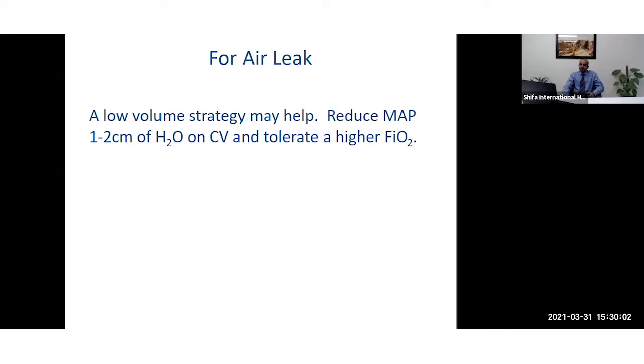For air leak syndrome, sometimes we might need to use a slightly low volume strategy by reducing the MAP and tolerating a higher FiO2 requirement until the air leak is settled.